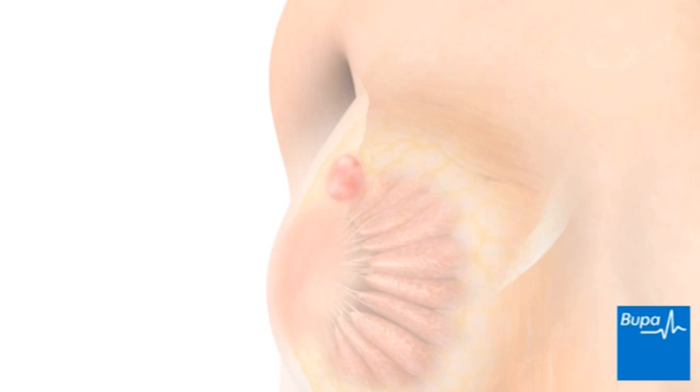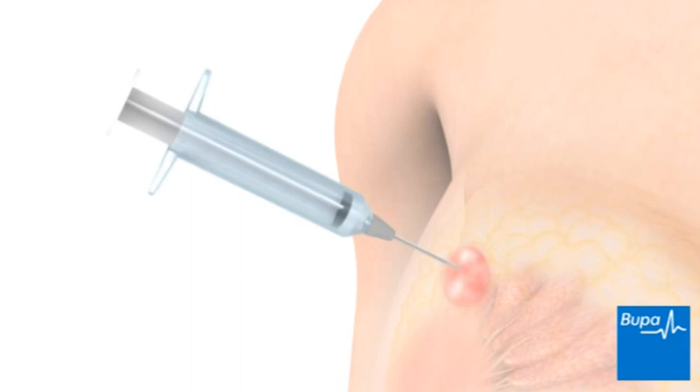Here we show an area of breast tissue that needs to be investigated. A fine needle is passed through the skin of your breast into the area being investigated. You may feel a slight sting as the needle is passed into your breast.